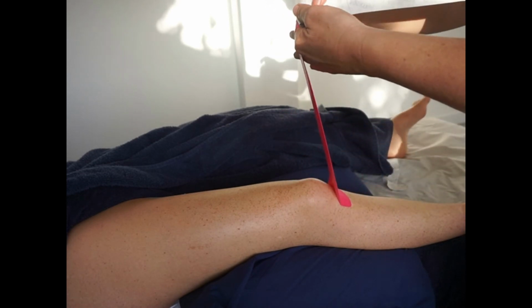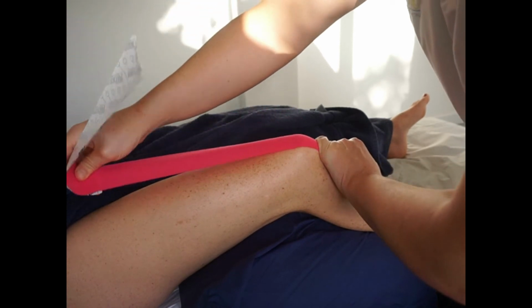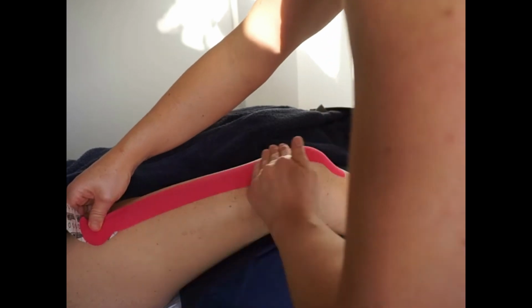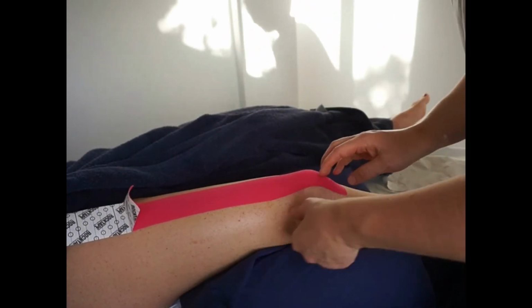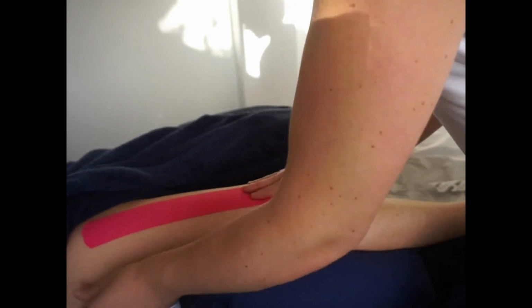Now I'm going to peel back the tape of the active piece and I'm going to add a light amount of stretch and ask my client to flex their knee, putting the target tissue on stretch. I rub it down to make sure it sticks well, and I get my client to completely relax the tissue and I apply the base with no tension and no stretch on it at all. Rub the tape down to make sure that it sticks well.